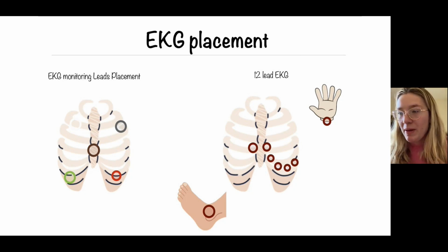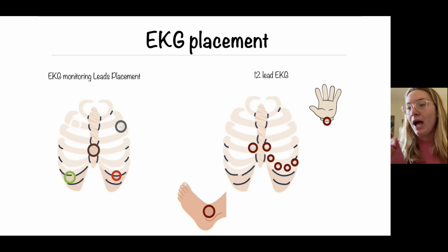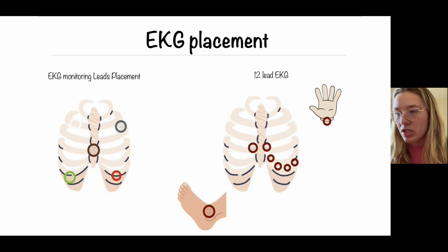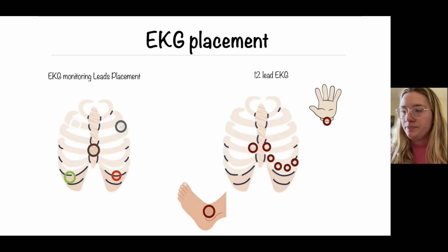Now, if you suspect something abnormal is going on, like maybe your patient's blood pressure dropped, or they're complaining of severe crushing chest pain, maybe radiating to the shoulder, we want to get a 12-lead EKG done on these patients. The reason we get a 12-lead EKG is because this lets us know in the now what in the world is happening to our patient.